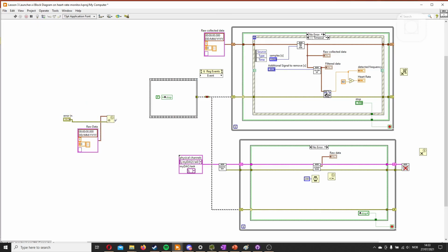And then place it in here. Let this wire go through this one so that we ensure that this thing starts before everything else. But the order in which these two happen doesn't matter because they're not dependent on each other. But we know that these things happen first before everything else, which is the important part.